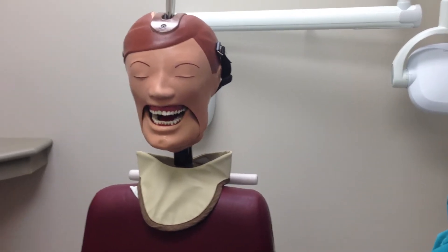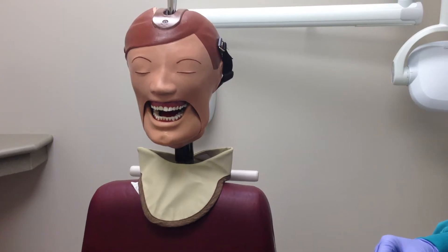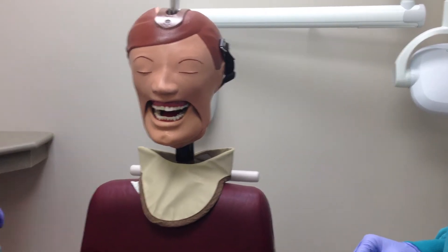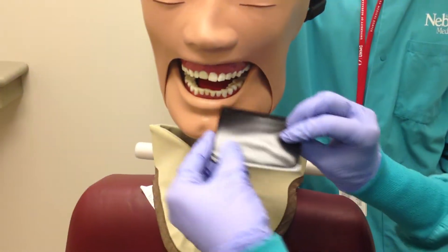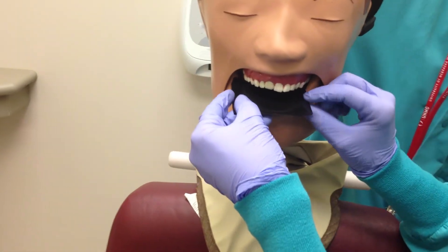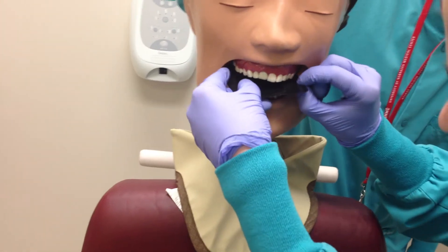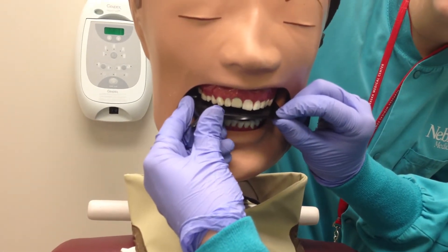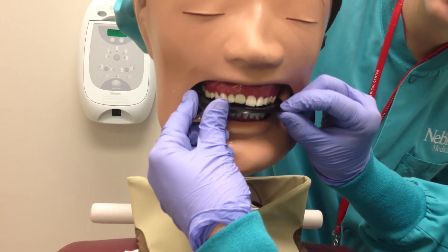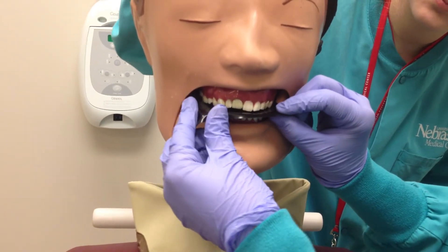Once the patient is positioned correctly, you are ready to start the procedure. Position a size 4 phosphor plate with the A side facing down and with its long axis horizontally. Insert the receptor into the patient's mouth as posteriorly as the patient's anatomy lets you. Instruct the patient to bite gently on the receptor, enough to hold but not enough to bend it.